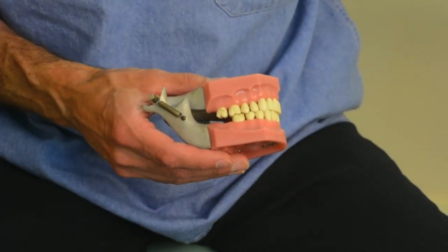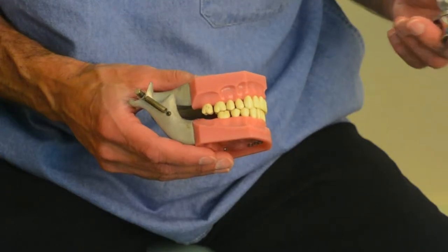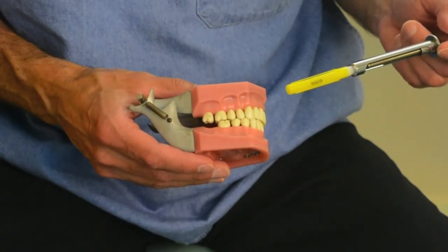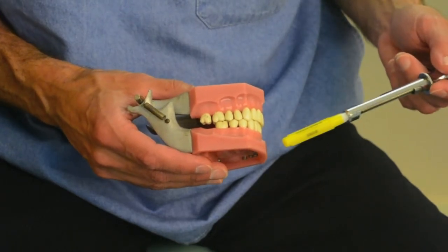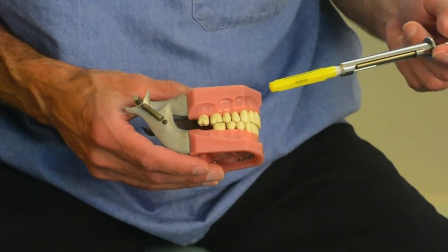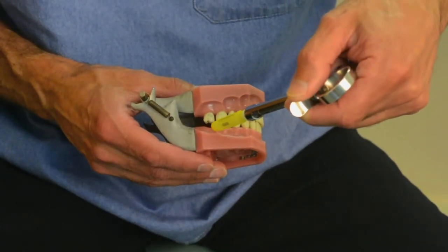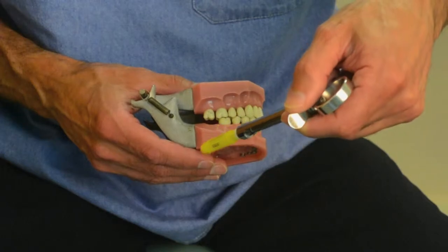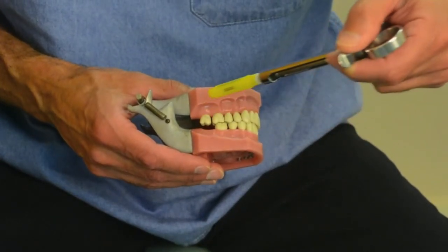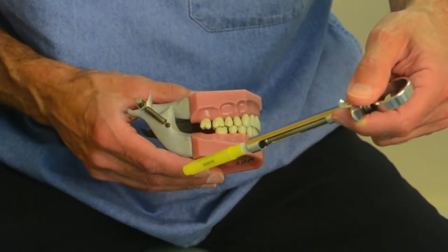We can supplement the block injections by using an infiltration technique. In the mandible, infiltration techniques typically do not work with the exception of the anterior mandible. But if you have a posterior segment that is fractured, and if you're able to deposit your anesthesia in the vicinity of the fracture close enough so that the anesthesia can diffuse into the fracture, you can obtain infiltration anesthesia along the fracture site.